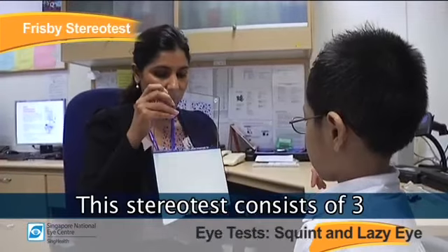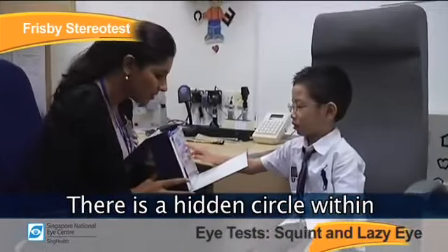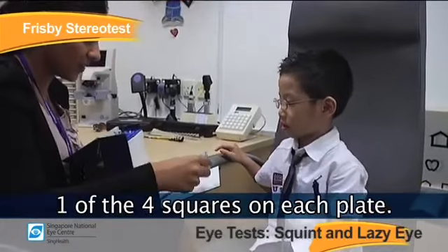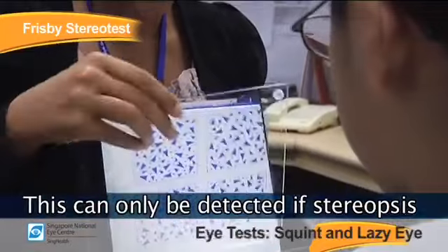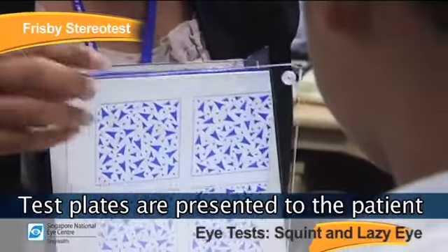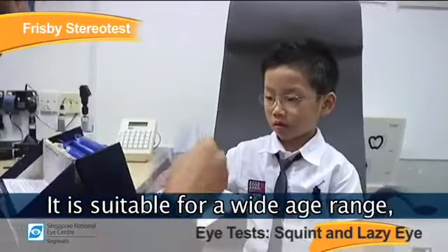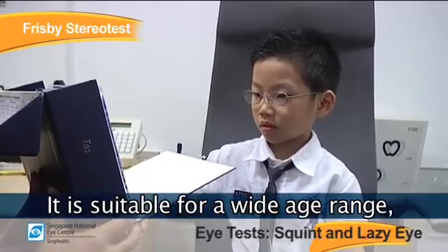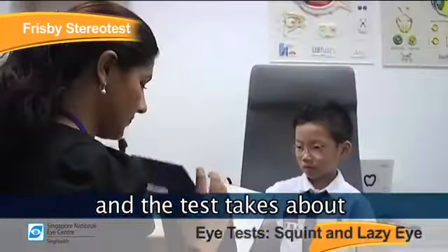This stereo test consists of 3 test plates of different thicknesses. There is a hidden circle within one of the 4 squares on each plate. This can only be detected if stereopsis is present. Test plates are presented to the patient at a distance of about 40 cm. It is suitable for a wide age range, even young preschoolers, and the test takes about 2 to 3 minutes to complete.